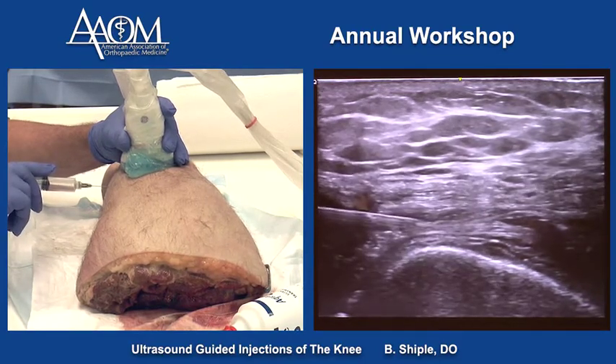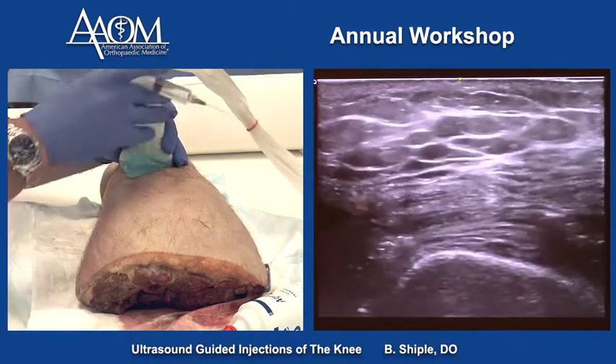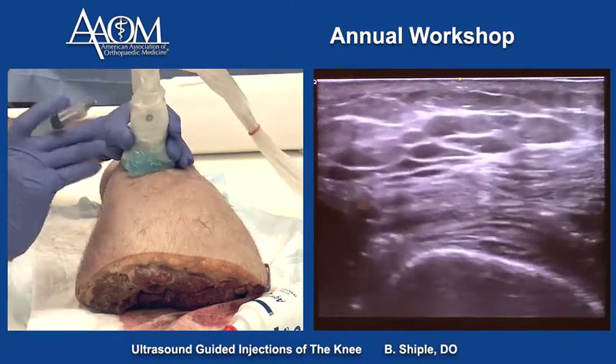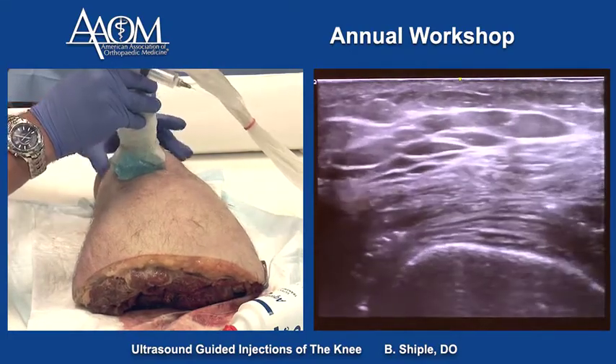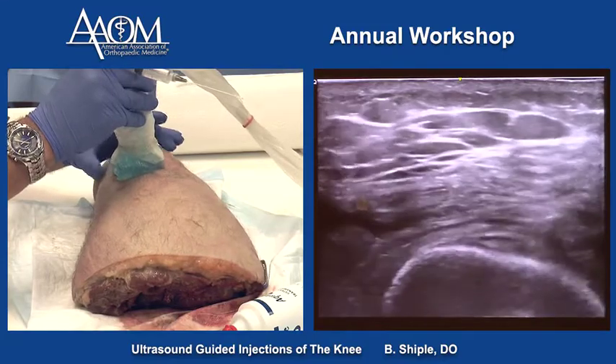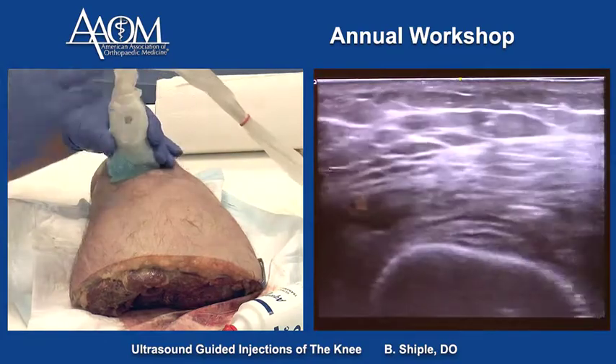There's no visible expansion of the fat pad or the quadriceps tendon, so I'm in the joint. That is the suprapatellar pouch injection technique to get into the knee joint without putting the hyaline cartilage at risk — unlike the classic Jackson technique, the anterior portals, or the classic Hackett-Hemwell technique that we're taught.